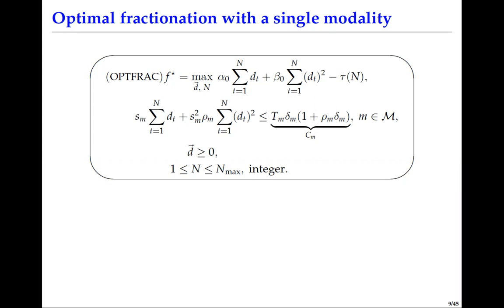As I mentioned to you earlier in those pictures, for that spatial localization idea, we'll actually have an intensity profile which will determine what dose is given to the tumor as well as what dose is given to each particular normal tissue. And that sparing factor can be calculated based on that geometry or anatomy of the problem, the physics of the problem. So this is the sparing factor. You see this as a squared term here because we have dose squared here. So corresponding to that, you have an SM squared here.